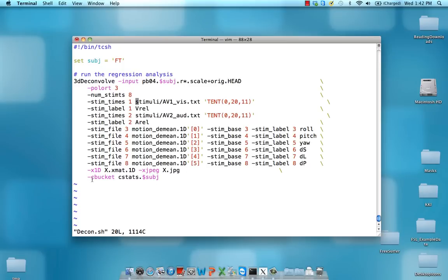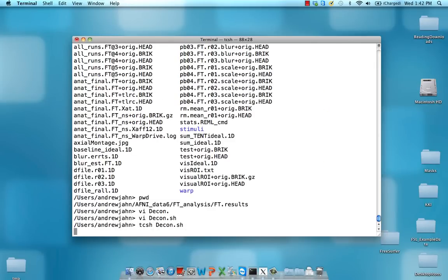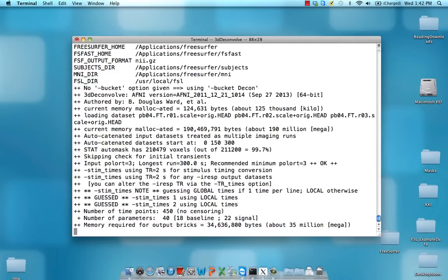I'm just outputting everything into this C bucket, so all the coefficient statistics into a separate data file. So let's go ahead and run this—might take just a little bit. While it's going, I'm going to talk some more.